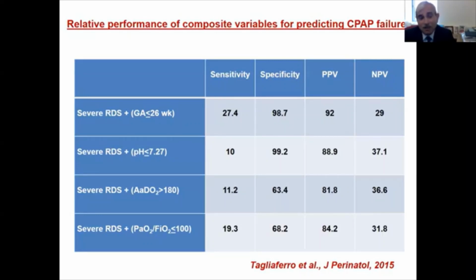And I'm concerned there is data on increased morbidities when high flow is used to wean babies off, and longer stays. Regarding NIPPV, Professor Ramanathan feels NIPPV works better than CPAP, but you feel bubble CPAP is better, I think.